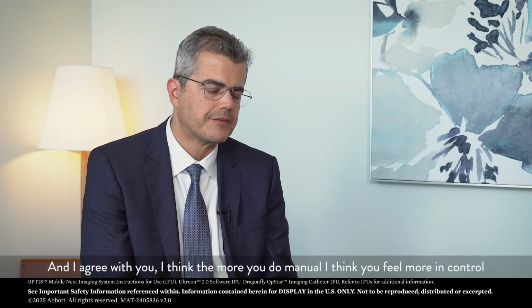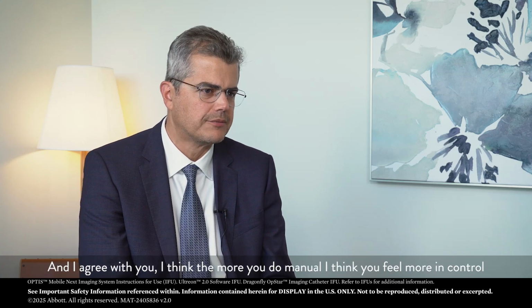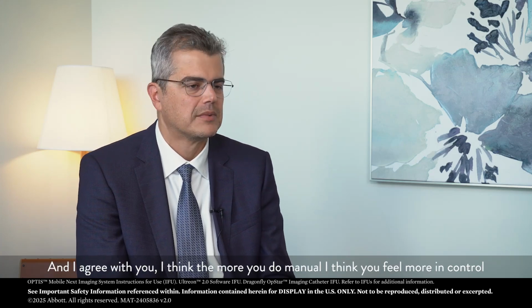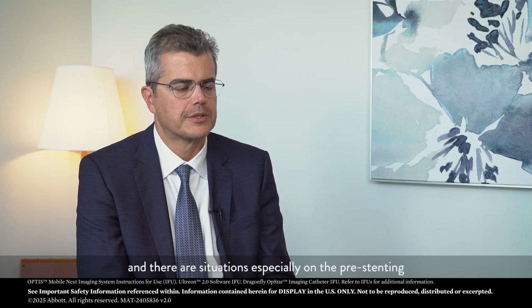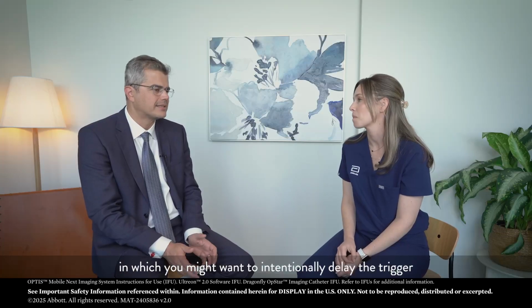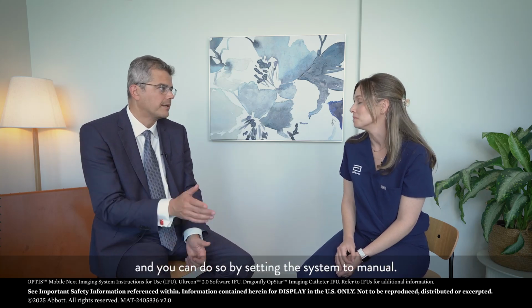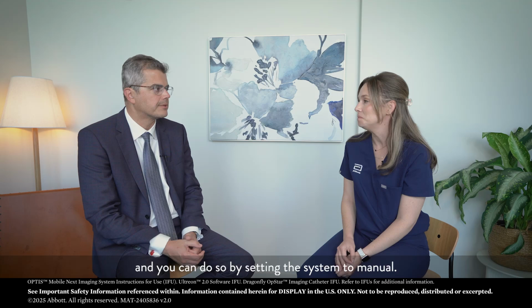And I agree with you. I think the more you do manual, I think you feel more in control. Mm-hmm. And there are situations, particularly on the pre-stenting, in which you might want to intentionally delay the trigger. And you can do so by setting your system to manual.